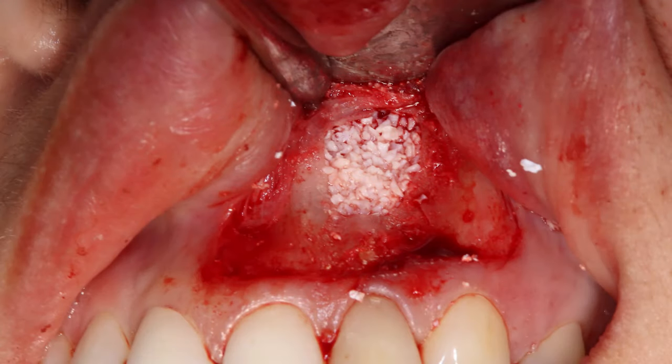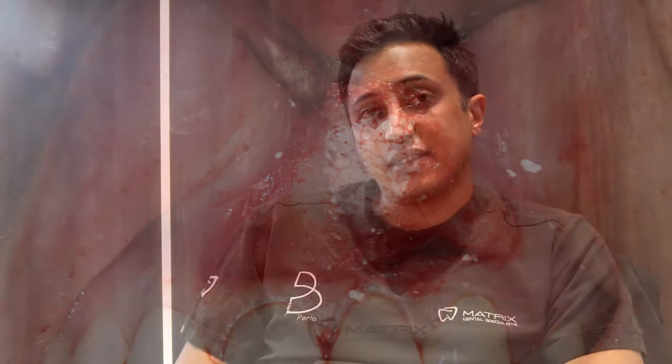Once the area was cleaned and disinfected, it is not good practice to leave the patient with a large hole within their bone, so we made use of biomaterials. There are a variety of bone replacement grafts; in this particular case it is derived from cow bone, called a xenograft. The purpose is to form a scaffold for your own bone to attach onto, integrate with, and grow. Importantly, these materials are dimensionally stable — it takes a while before the body can eradicate the material, which preserves the required volume of bone and tissue.